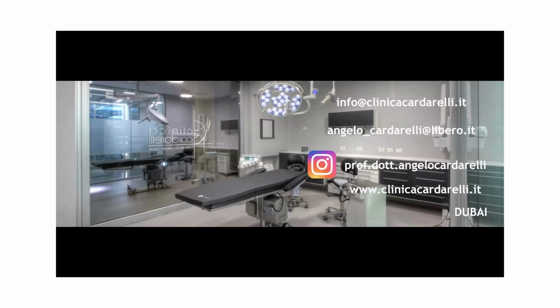But we have something almost like osseointegration compared with the previous customized implant. We can have close contact, like healing, between the bone and the customized implant, but for sure the bone doesn't go on the top. It's impossible because the customized implant is on the top of the bone.